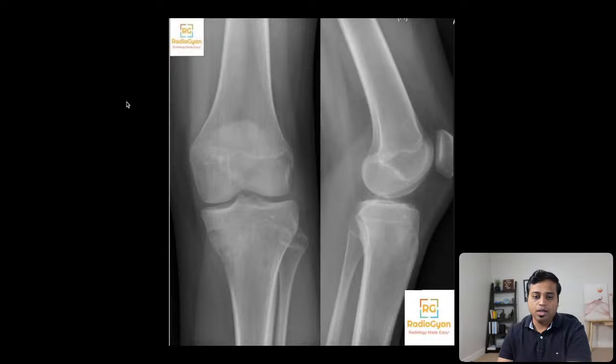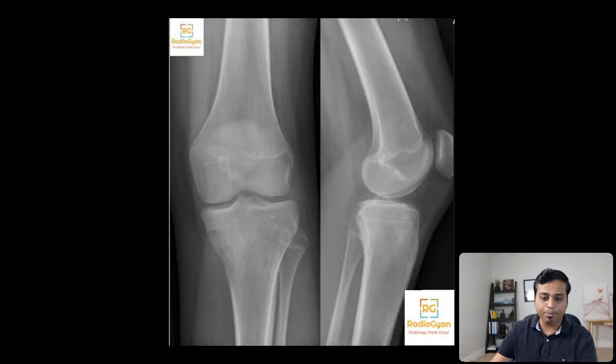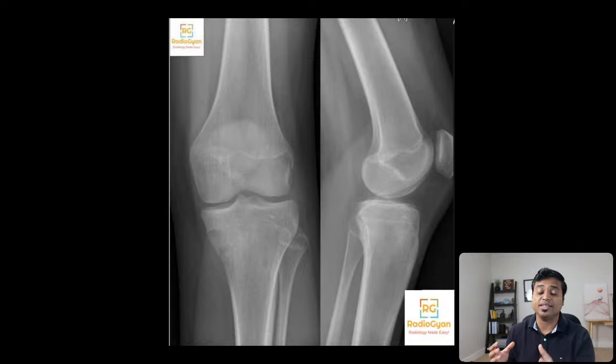Moving on to the next case — a knee radiograph. Looking at the epiphyses, they are not completely fused; you can see the epiphyseal line still. This is again a pediatric patient. Any time you get a radiograph, I can't stress this enough — first try to age the patient. This is a young patient. Now let's try to find where the pathology is.